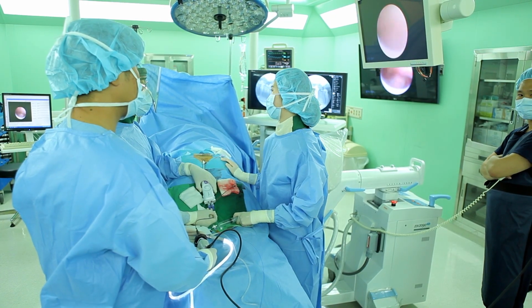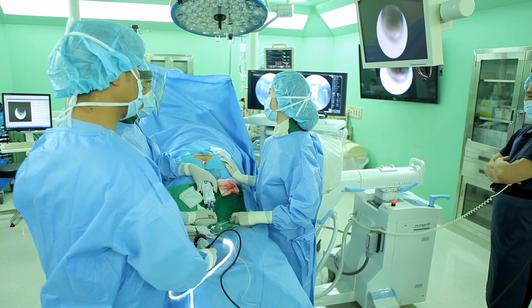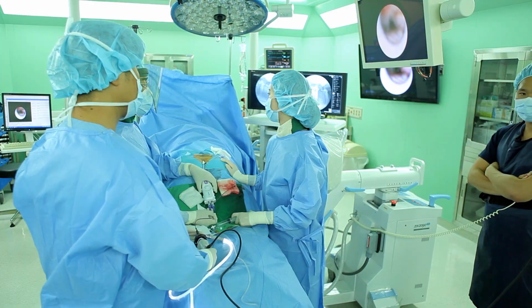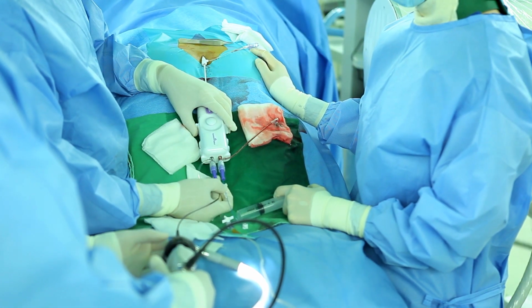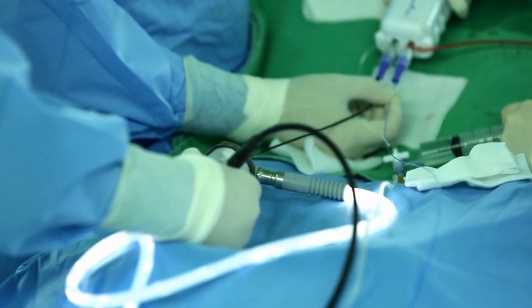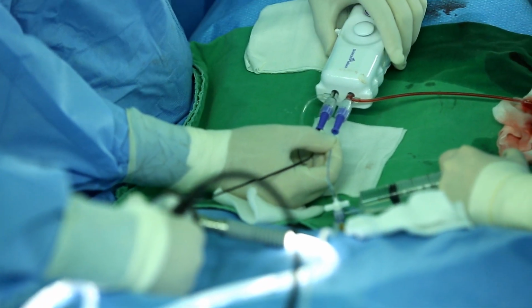You should push 1 to 2 cc saline intermittently, checking for an unclean view because of the bleeding or disc particles, and push 5 cc saline for adhesion lysis for catheter advancement.